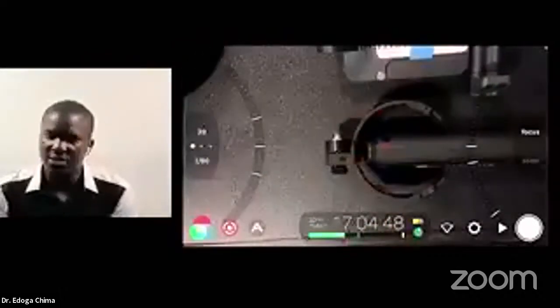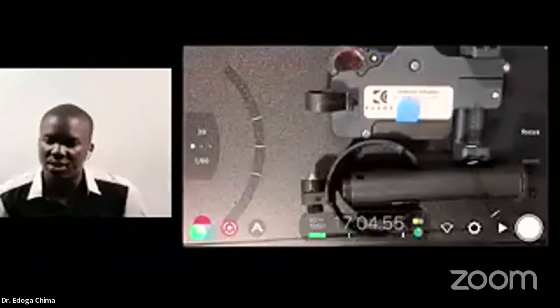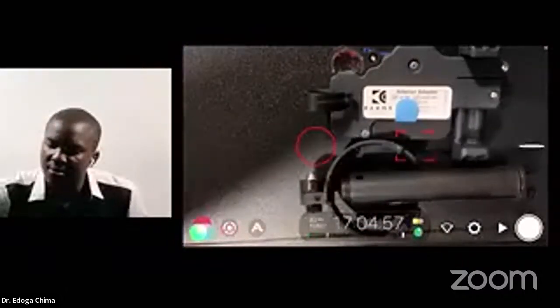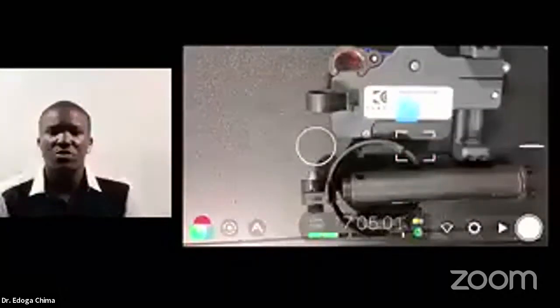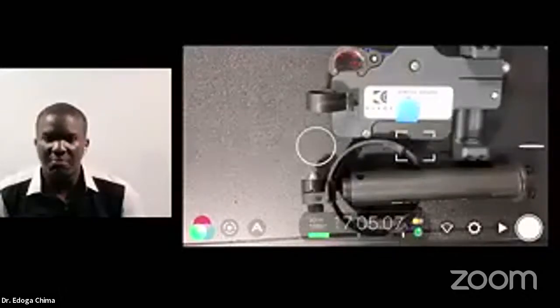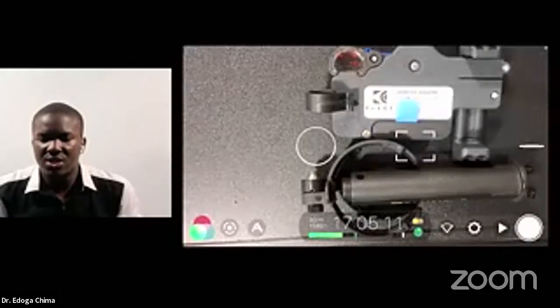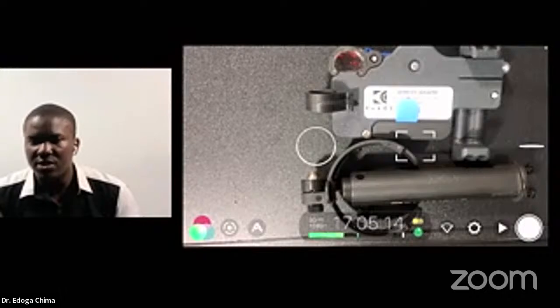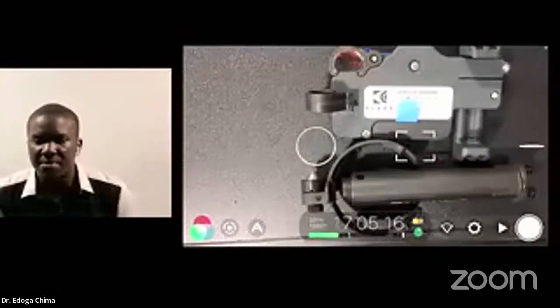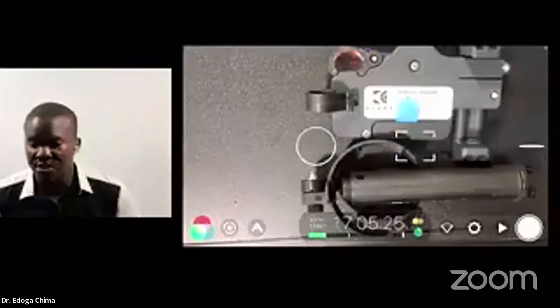So let me quickly open this Fundus adapter to give us an idea of what an adapter is. It's a Fundus adapter that you are seeing on your screen. So I've focused on it. This Fundus adapter was made by an American company, but they are actually out of business. You were able to give me some free copies of the adapter, some of which I shared during the last OSN and the most recent OSN that just passed.